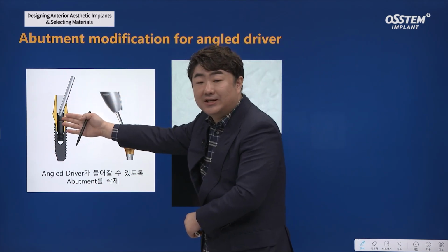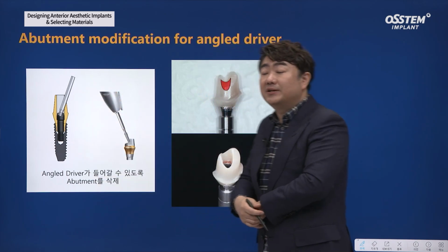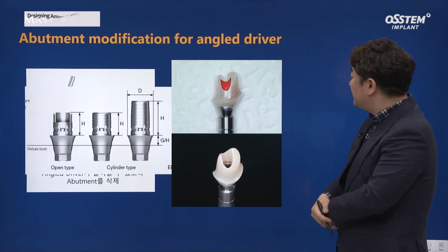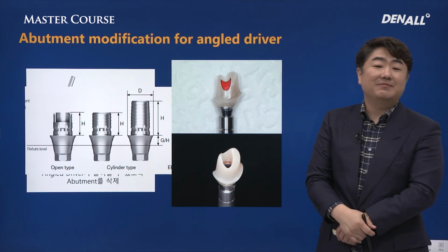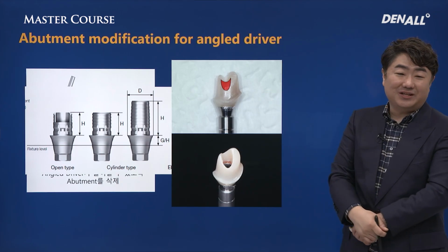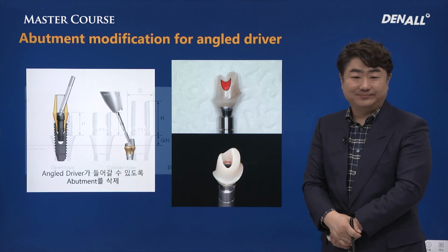At times, you may need to adjust abutment. It is easier to adjust and remove stock abutment. In the case of zirconia abutment, there's link abutment within, and there may be need to remove a bit of link abutment as well. However, if you do it, there can be disadvantages in terms of bonding, so we need to pay a lot of attention.